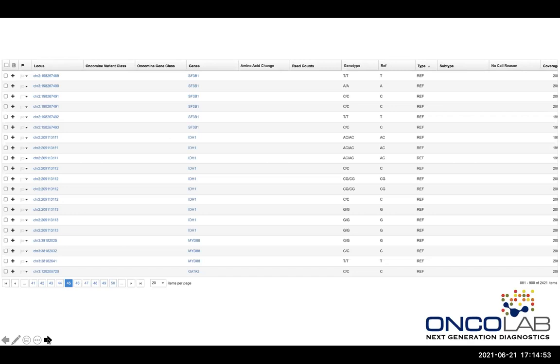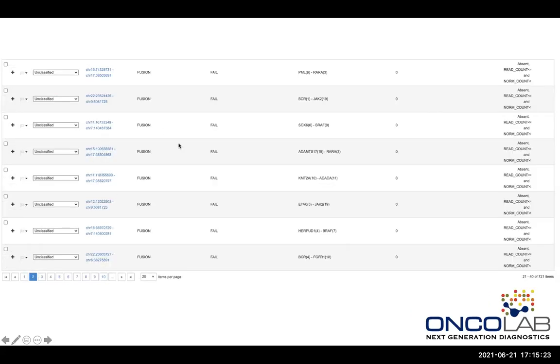And then there are quality scores and lots of other things that we use to determine whether a variant is true or not. The supplier, Thermo Fisher, also has a standard filter, but we found that filter to be overly restrictive, as it will only call variants that have been annotated and documented in COSMIC, the database. So you'll miss things.